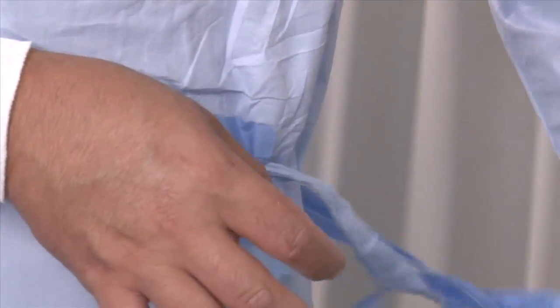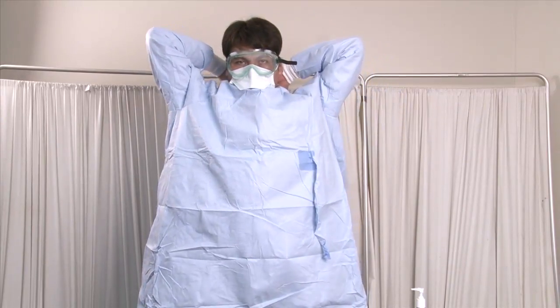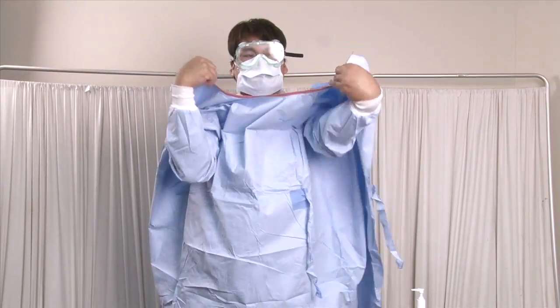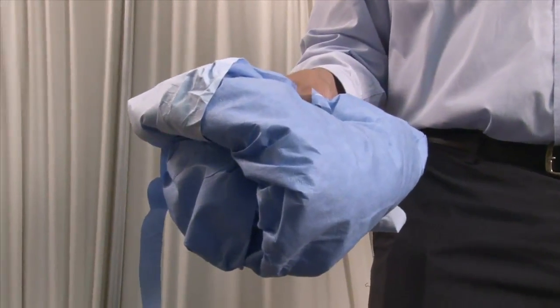Step 6 — Removing the gown: Unfasten the ties of the gown and peel the gown away from the neck and shoulders. Turn the contaminated outside toward the inside. Fold or roll the gown into a bundle and discard it in the biosafety bag.